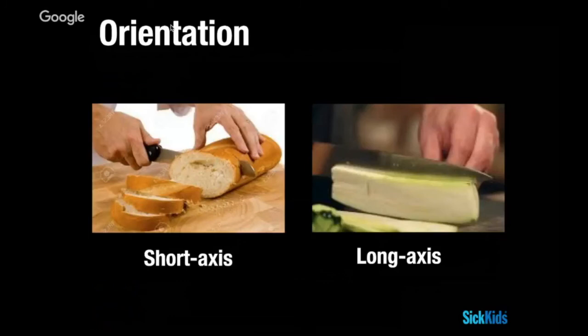I don't have to say like I'm doing a mid-axial abduction, like, too much. But you'll certainly encounter people that they don't like to use the term longitudinal, they like to use the term sagittal. There's all these other ways in which we can express things. I think you'll be well served if you talk about the short axis of the kidney, the long axis of the kidney, and not a semi-oblique coronal probe position.